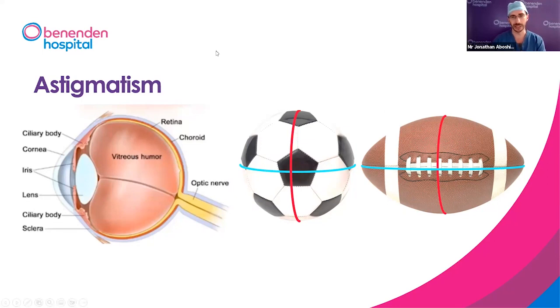You can see here that if you were to cut a football in half, or even look at the side of a football, the curvature of the vertical red line, or what we call a meridian, that line of curvature, would be exactly the same curvature as the horizontal blue line. And that would be completely spherical. That would be a non-toric sort of surface. And I'll tell you what toric means in a moment. But basically, toric is another word for a lens that corrects astigmatism. It has different powers in two perpendicular planes, normally the vertical and horizontal, but not always vertical and horizontal.